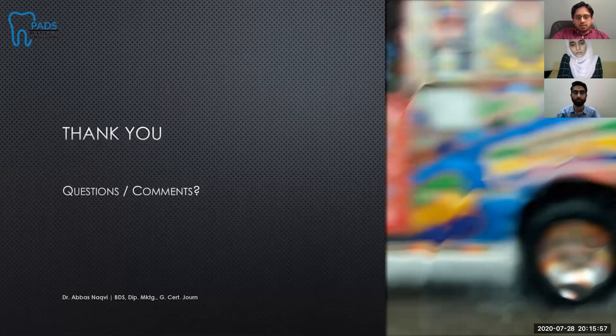Ring lights I already answered. Diffusers, yes, you can use diffusers for sure. Rubber dams affect hue, yes, might be slightly, so if you want, use a black one or a gray one. Best aperture for intraoral photography, usually narrow apertures, beginning from 16 onwards, 22, 32, anything narrower. Okay. White and black background, I mentioned that. It really depends on the subject and you have to do the meter reading.